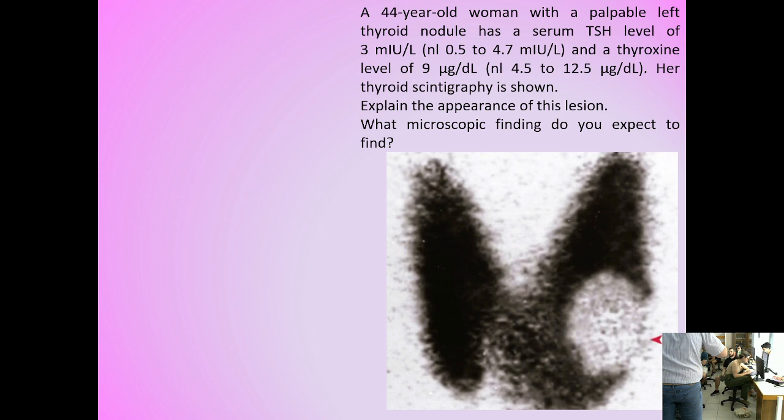So they must tell us where the suspicion nodule is located, and when we put the thyroid the right way and see which is the left lobe, which is the right lobe, we'll know where to take many sections. Of course, if it's a nodule, most probably we can see it with our eyes. However, it's not always so. If there are many small lesions, perhaps they can be macroscopically undetectable. So, clinical information is always very helpful for us to do our job.